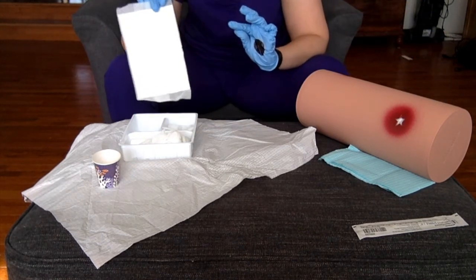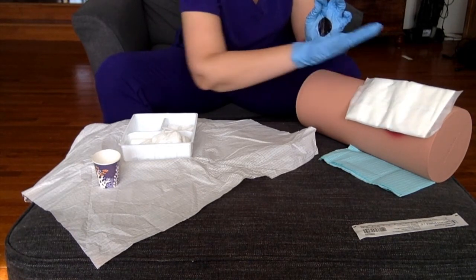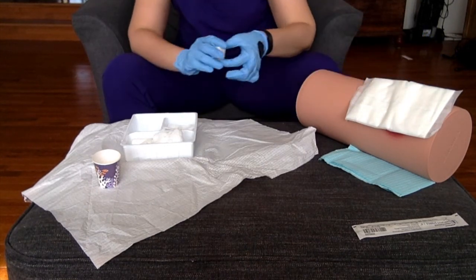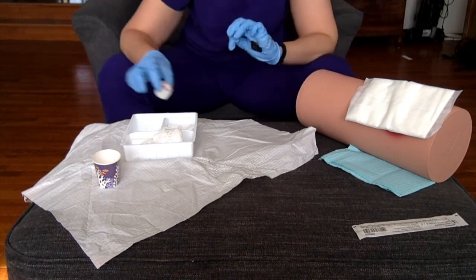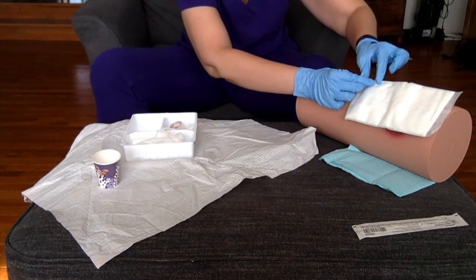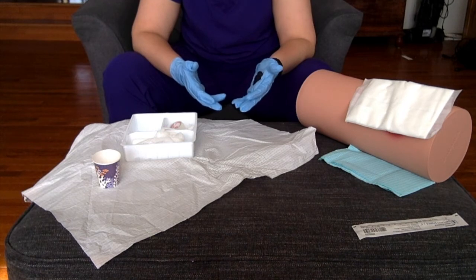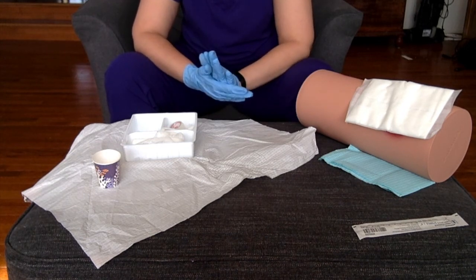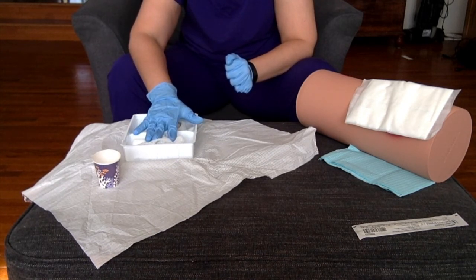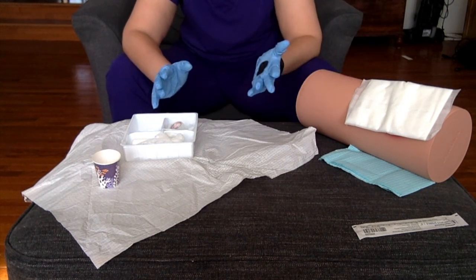At this point I'm done with the packing. I grab the ABD pad and lay it over the wound. Once it's completely covered I'm done being sterile. I need to tape down all four sides of the dressing, fill out the label from your kit, and stick it on the dressing or the tape so everybody knows when you last did the dressing change. The key point is keeping sterile sterile — only the sterile hand touches the kit after setup and irrigation begins, and the clean hand is for patient care. Thank you.